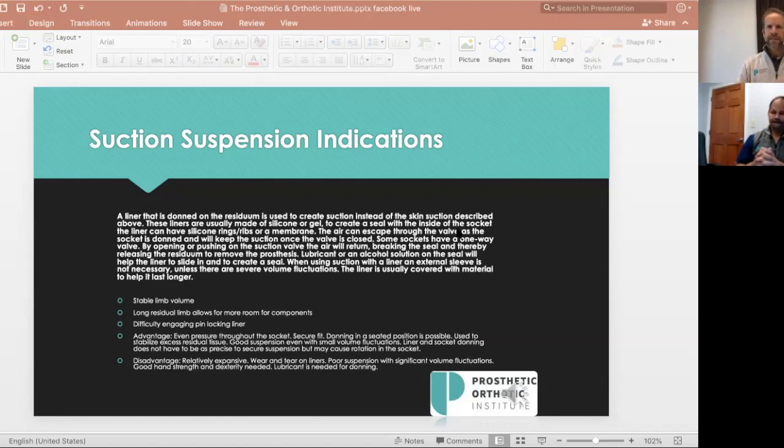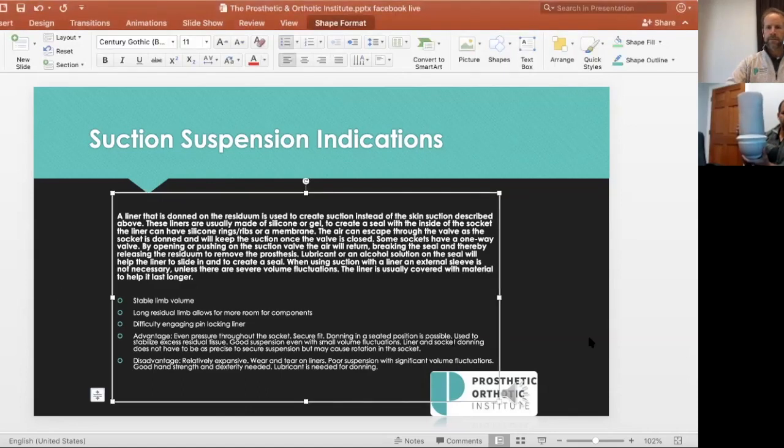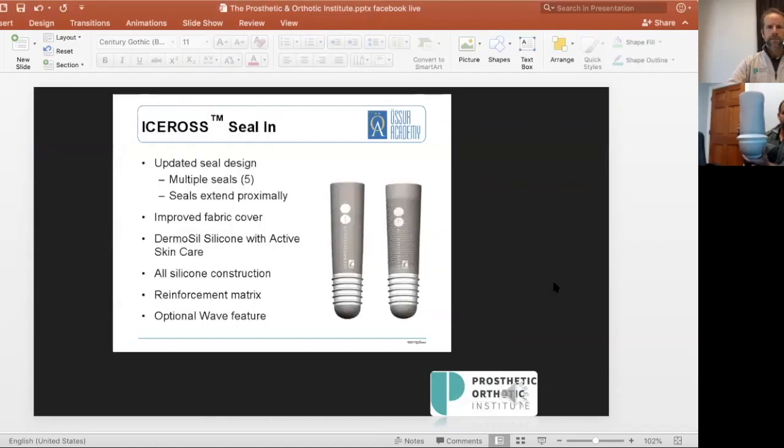Do you have an example of a suction system so that we can take a look and see how that works? I do. So I want to cover with our audience today a couple of different suction suspension mechanisms. So here we have a cylinder liner, and the seal, I think it's on my next slide here. Go back to that. Yeah, there we go. Perfect. So this is just an example of suction. What I want our audience to understand is there's a number of different types of suction systems out there.